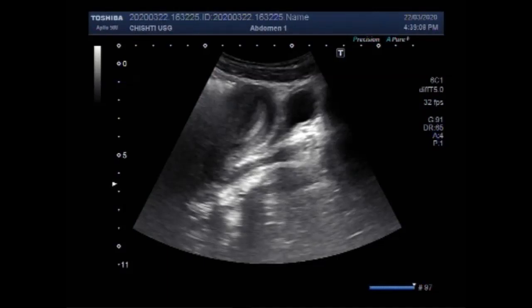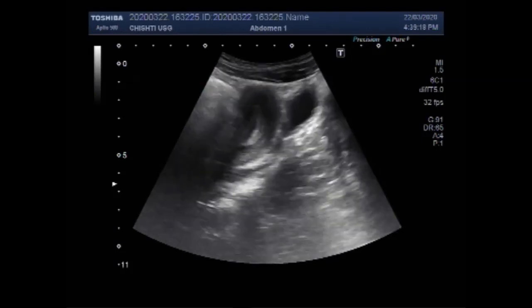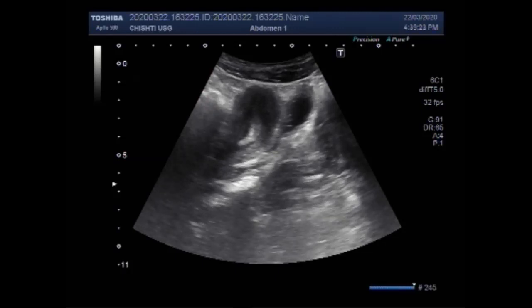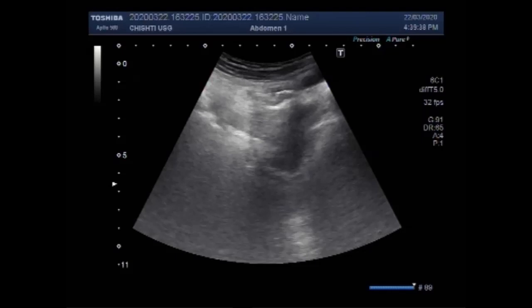Dear viewers, I hope you are all fine. This ultrasound video shows acute appendicitis and its differential diagnosis. You can see the uterus, urinary bladder — this is the urinary bladder, this is the uterus, this is the cervix. The patient was suffering from severe pain in the right iliac fossa.